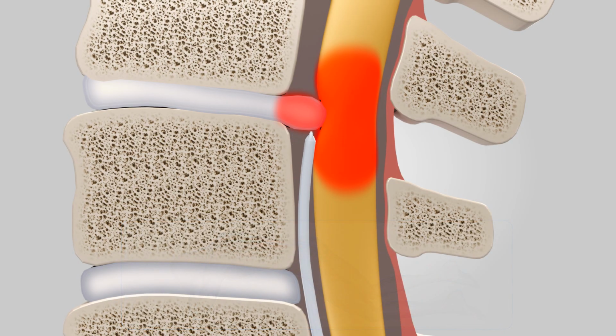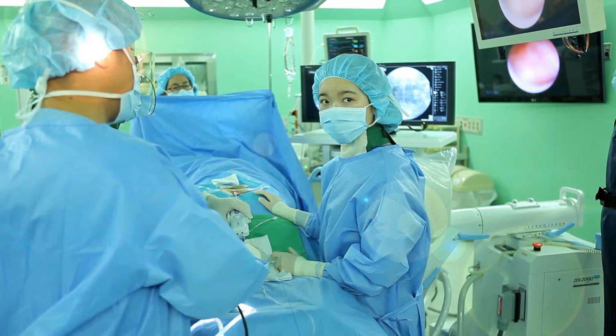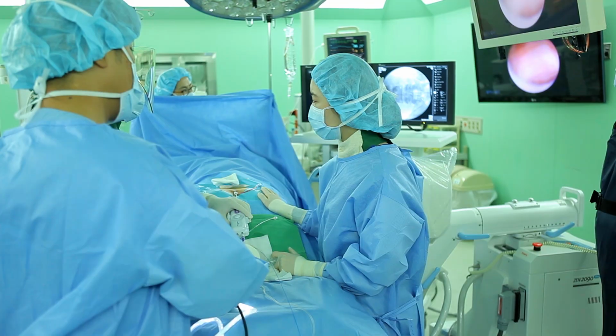When stimulating, if the patient appeals the pain on the leg, it means there is a nerve root. Never shoot that point. If the patient appeals the pain on the disc or doesn't feel the pain in spite of stimulating, it means there is not a root, so you can go shooting. Stimulating is a technique for safety for patient and surgeon. You can understand where the right place to fire the laser is by stimulating.